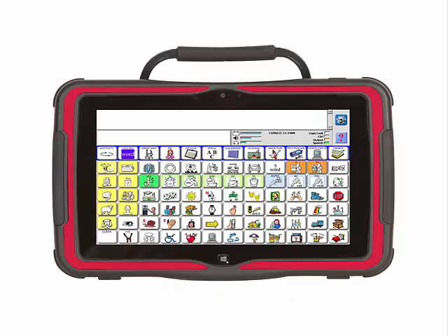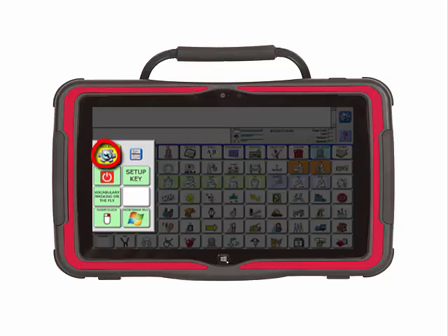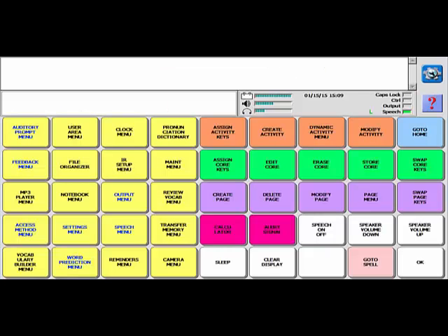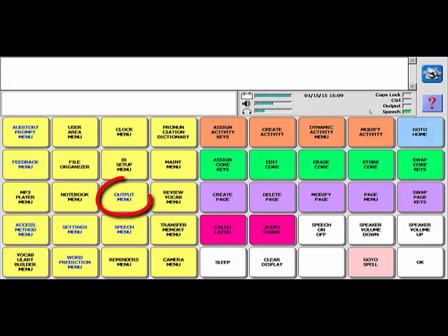Now let's set the device so it can send keyboard and mouse commands to a computer. On your Accent, enter the Toolbox, then select the Output menu — it is a yellow key in the third row.